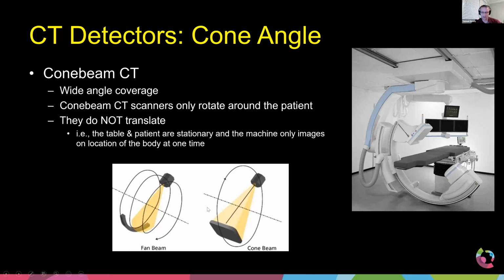Very briefly, what is cone beam CT? What we're very familiar with, of course, is traditional CT scanners. You have the fan angle, so you have the wide detectors, and that goes around the body as it spins around, but it's thin. It only normally covers maybe 4 centimeters. It could cover a little bit more, maybe 8 centimeters. Normally it doesn't cover a lot. So it has to spin fast, and the body has to translate through the scanner so that we can scan a large area.